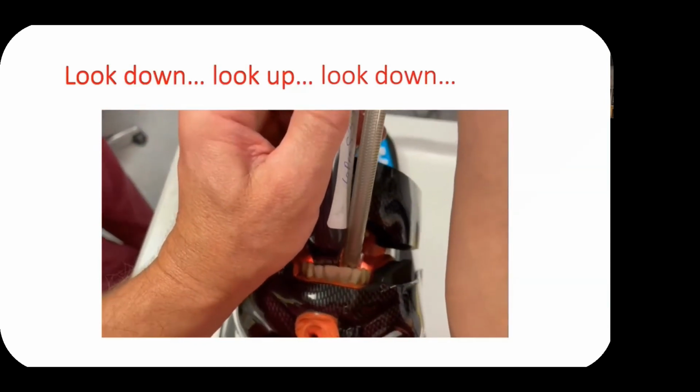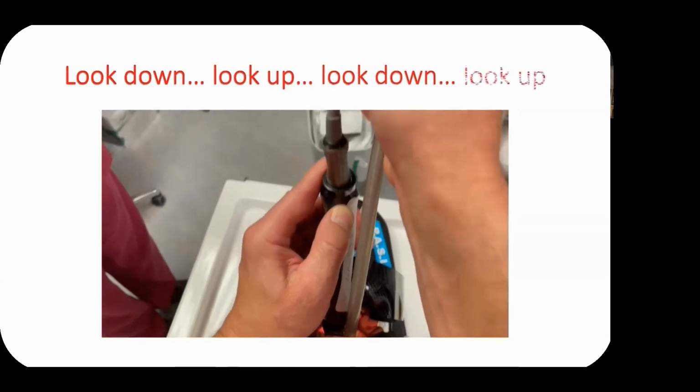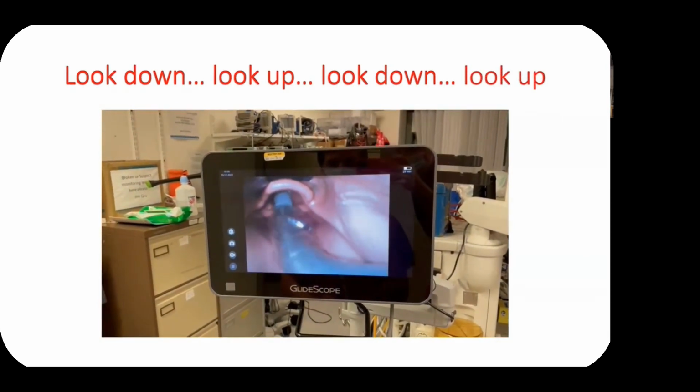It is important to do this to avoid pharyngeal injury. When the tube tip disappears from view, then look up to complete the delivery to the vocal cords. You should avoid driving the tip of the blade into the vallecula as you would do with a Macintosh. This is because it increases the angle between the pharynx and the larynx, making tube passage more difficult.